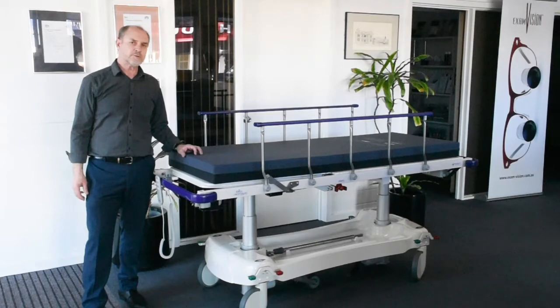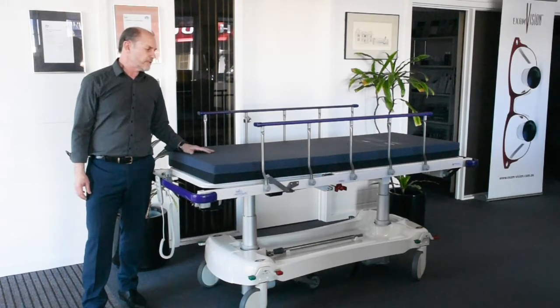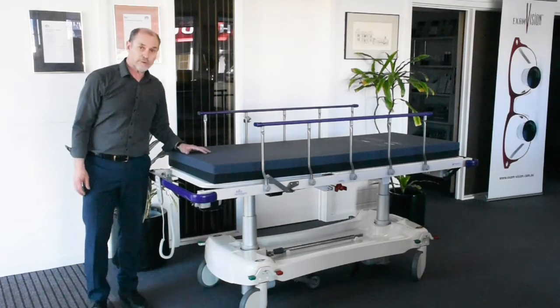Hi, I'm Chris from Surgical and Medical Supplies. This patient transfer barouche is the Contour Classic electric version, made by Modsul right here in Australia. Let me run through it with you.